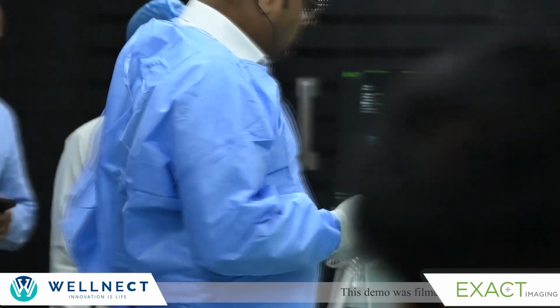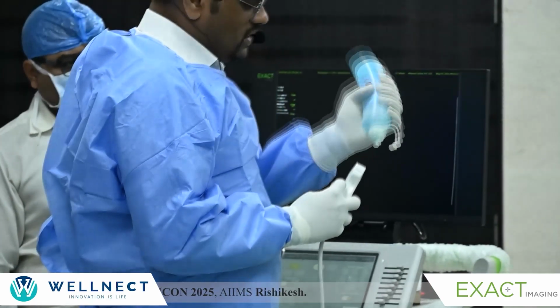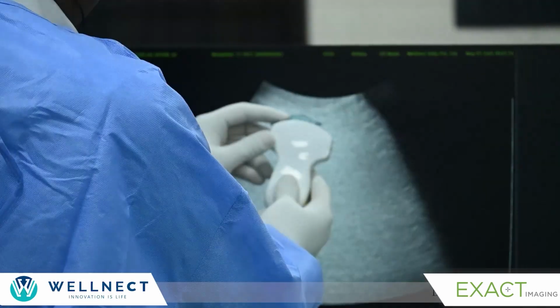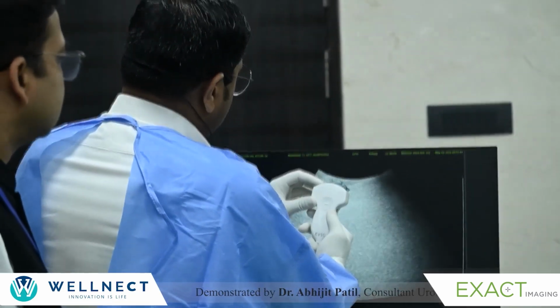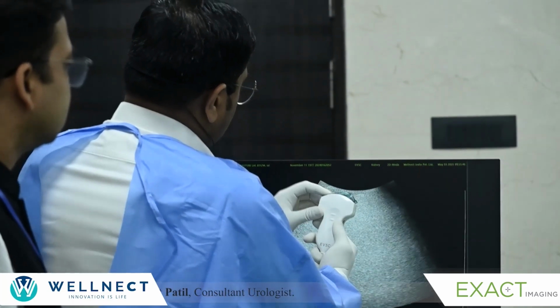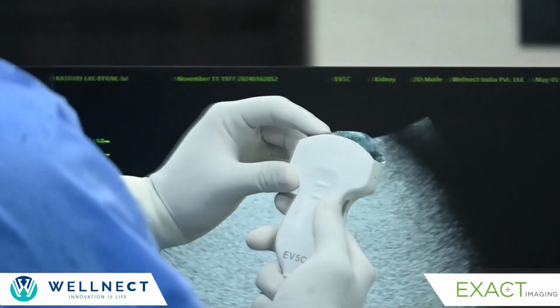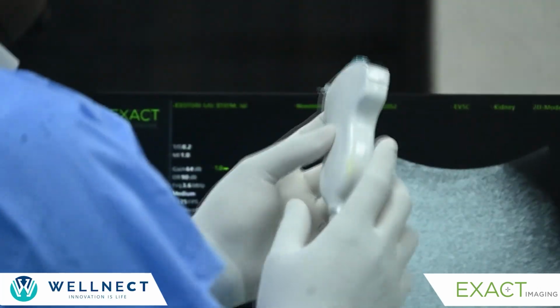So probably you will not be seeing the bladder in much detail because it is collapsed, but I will definitely show you how the kidneys look. My probe is translating into the cranial end. If I reverse the probe, can you see I am moving at the cranial end of the probe, but there is a movement at the caudal end of the probe? My complete anatomy changes. So it should always be corresponding. Now that means my probe is correctly oriented.